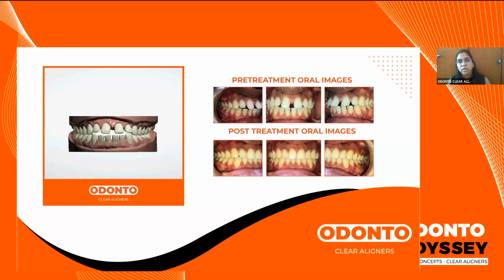So based on the clinical patient whom you have, you will have to accordingly factor in the number of sets which are required. In case of relapse cases, it can be around 10 sets which are required, but anything up to 20 sets, we still count it as mild, and it goes into the minimum number. Now, that is what we program into the aligner, and you will have to accordingly calculate.